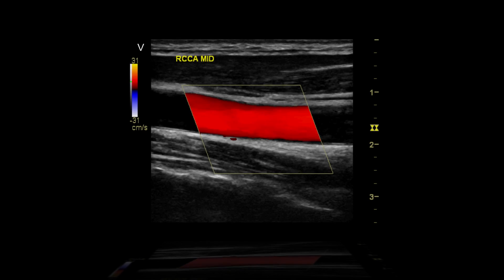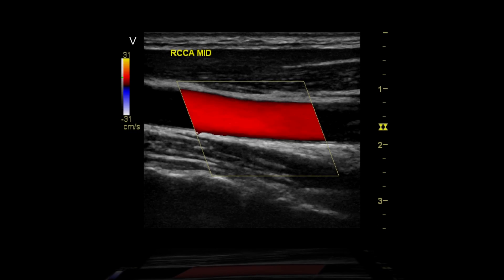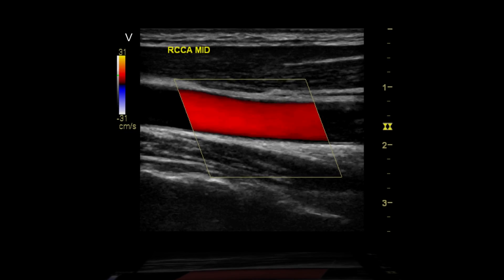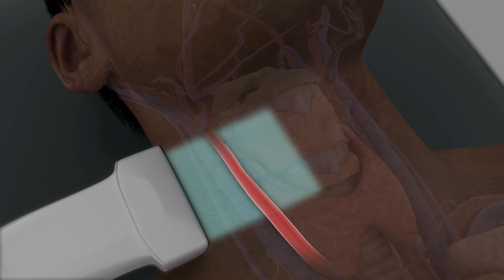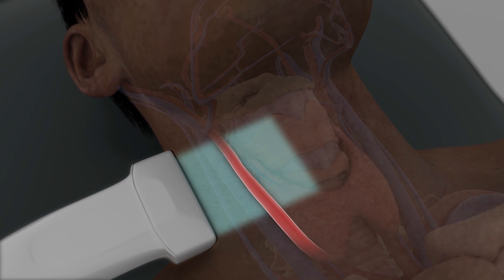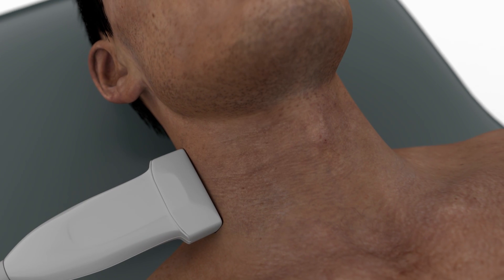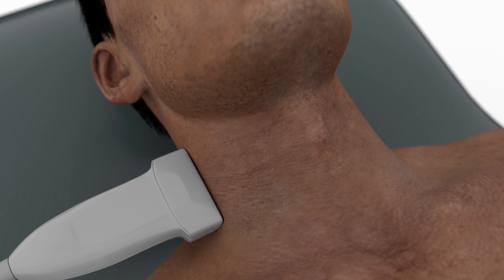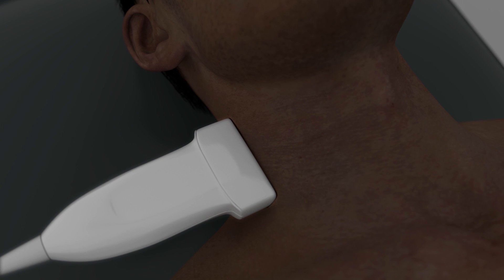Doppler ultrasound is used to detect flow within vessels. To demonstrate the use of Doppler ultrasound, we will obtain a mid-long axis view of the common carotid artery using a high-frequency linear transducer.